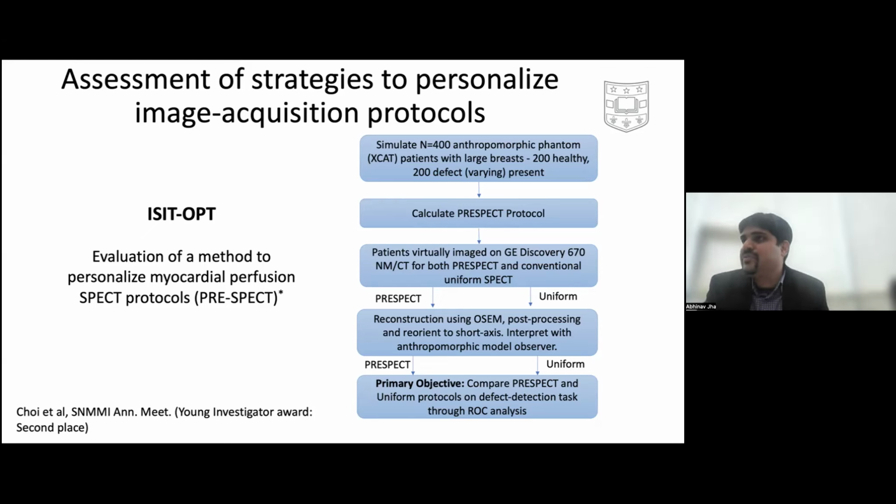We have different times at each projection angle. When you are gathering more signal from this source, because of the scatter distribution around the patient, at each angle we have different scatter problems. So scatter at one angle might be more emphasized.